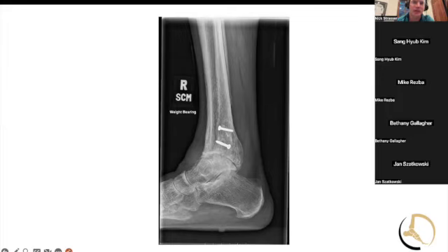What about how you get that talus back? Sorry, Nick, I would probably just try to do this percutaneously. Okay, tell me more. So I'd probably make two incisions and take a burr, not even necessarily a high-speed burr, but one of those burrs that irrigates. I can't think of the name right now. And just put percutaneous screws in. Instead of putting any plate or anything, I think you could. There's not a lot of cartilage here. You just need to really freshen up the joint edges.